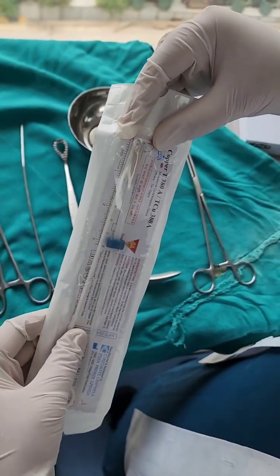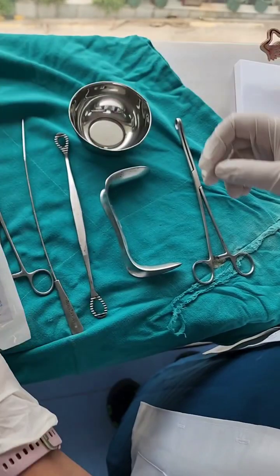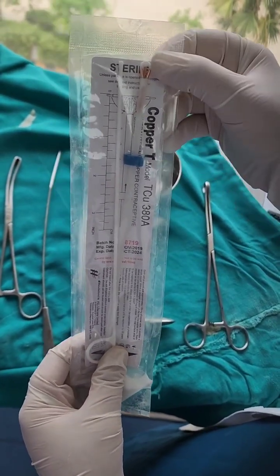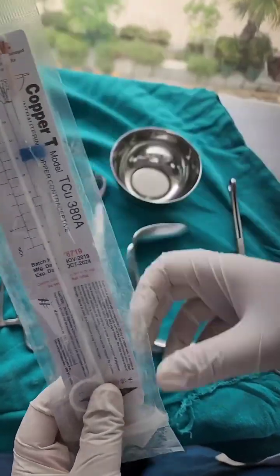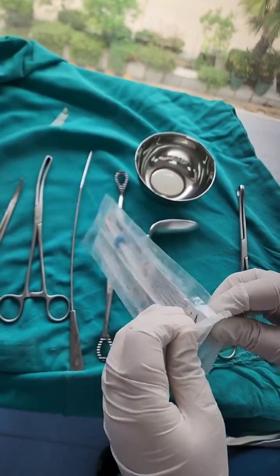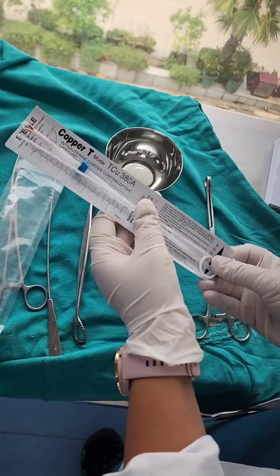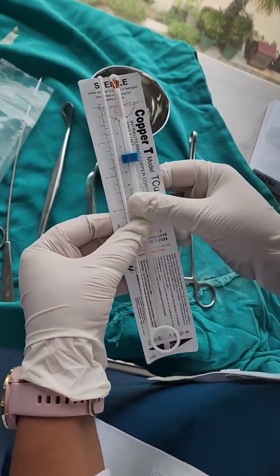Using our fingers inside the packet only, while the copper T is still inside the packet, we insert the horizontal limbs into the plunger. Here you can see a pre-loaded copper T where the horizontal limbs have been introduced inside the plunger. Now we open the copper T packet and take it out.